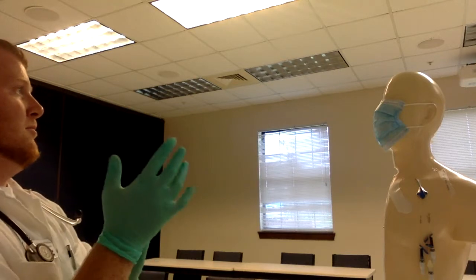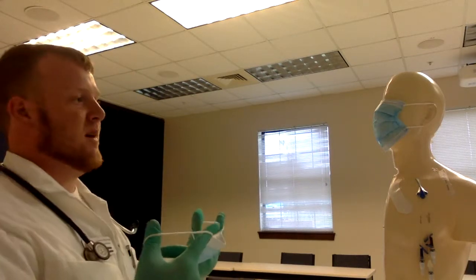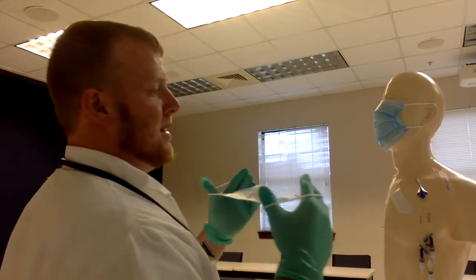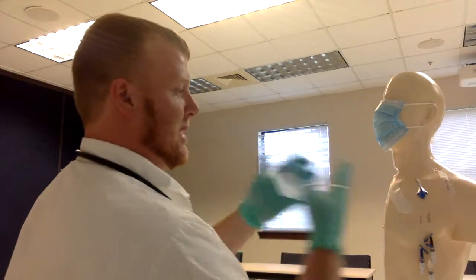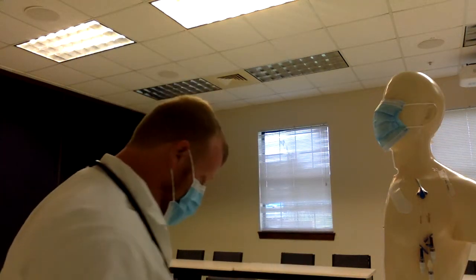One other step that I would like to add: before removing this dressing, there's a mask for myself that I need to have on before I remove the dressing. The dressing is not 100% off right now. I peeled up the edges, but do not continue without having your mask on because you don't want to contaminate that area. Okay, so put your mask on. Form fit it through your nose.